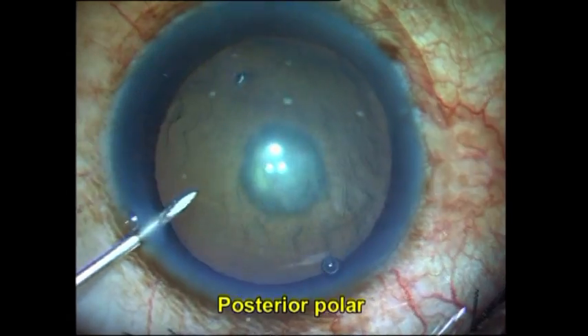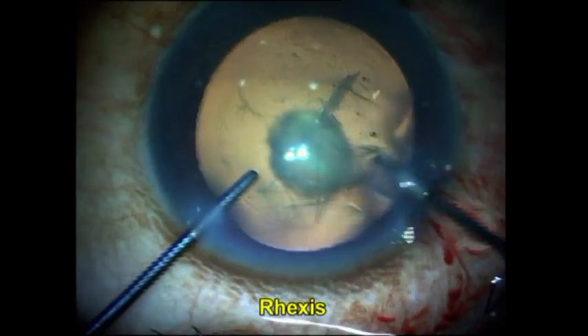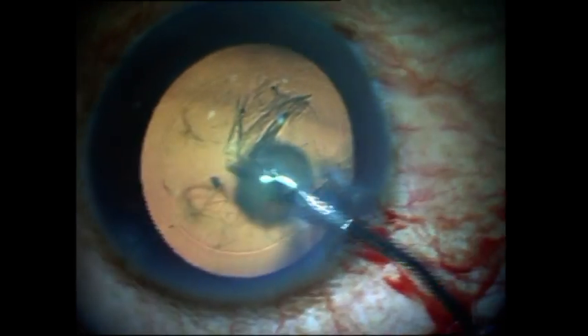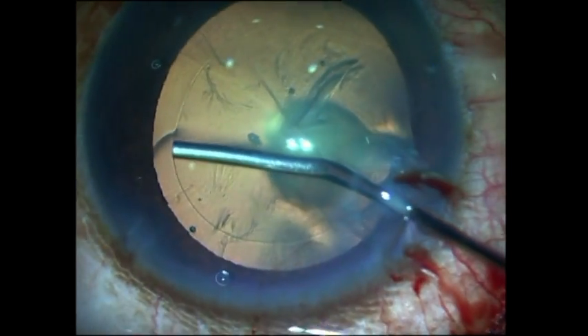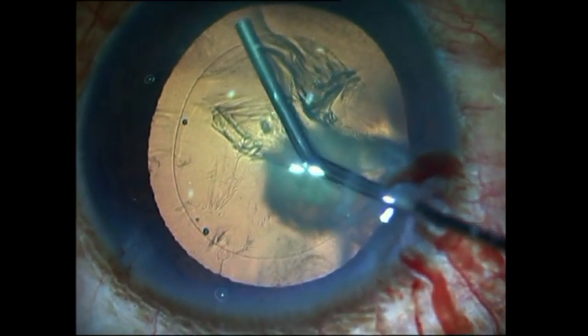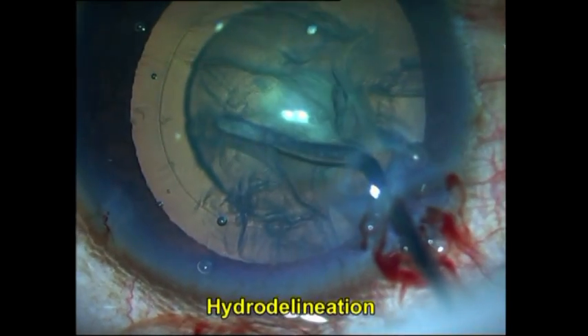Here's another case of a posterior polar cataract. Again I do the rhexis, and again it's important to make it large enough to be able to do an optic capture if required. This is how I perform the gentle multi-quadrant limited visco dissection — I do not let the viscoelastic go more posterior; it is just generally limited to a couple of millimeters of the rhexis rim.